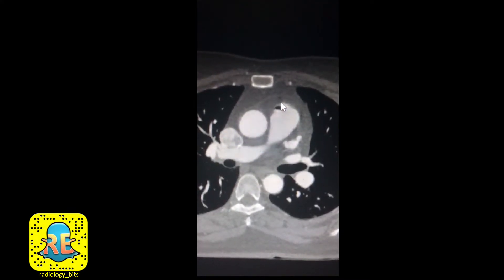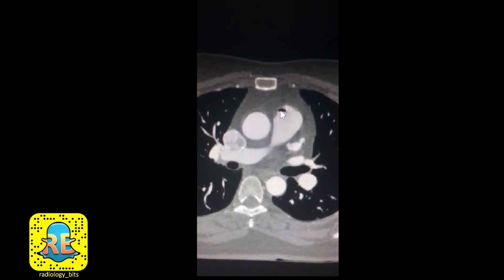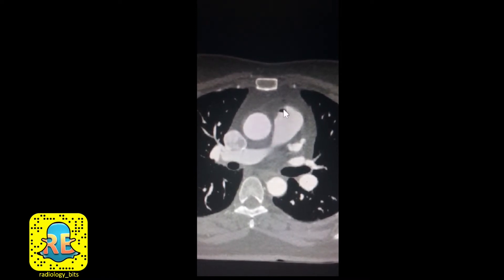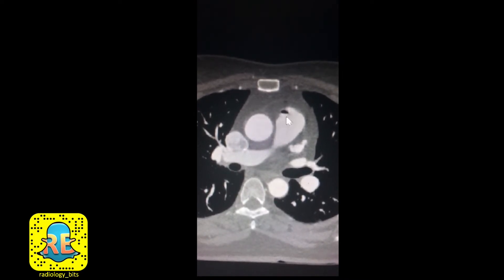One thing that's understandable is that air goes to the higher areas — the non-dependent area — since the patient is lying on his back. So if you look at the air bubble here, it's in a non-dependent area. Another feature is that since it's gas and fluid, a gaseous area with a fluid area, it's expected to have a fluid level, sometimes especially if the air bubble is big.